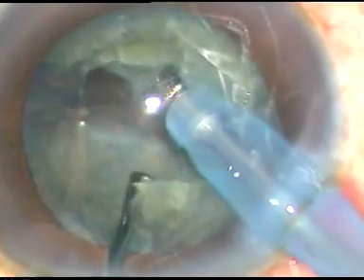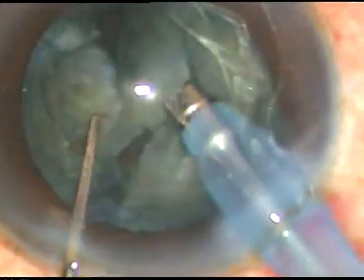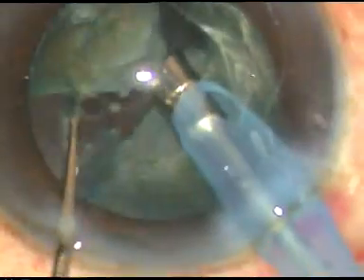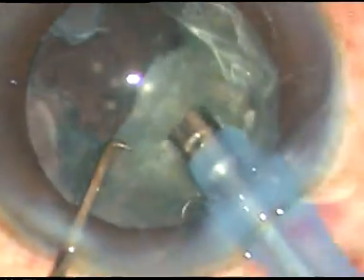After going to a certain depth, just apply opposite forces and the nucleus divides into two halves. This is how you hold one half and chop it. This is a teaching video and every step is being done slowly to demonstrate the steps. This is how you hold a fragment and emulsify it — I'm in phaco two mode.